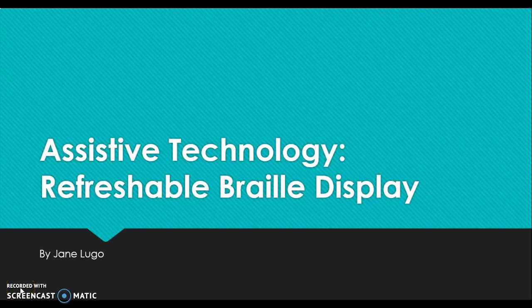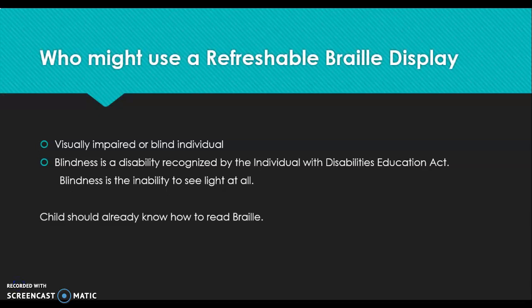There are many different assistive technologies out in the world today, and the one that we will be discussing and reviewing is the Refreshable Braille display. Before I go into the benefits and what a Refreshable Braille display actually is, I wanted to go over who might actually be using a Refreshable Braille display.